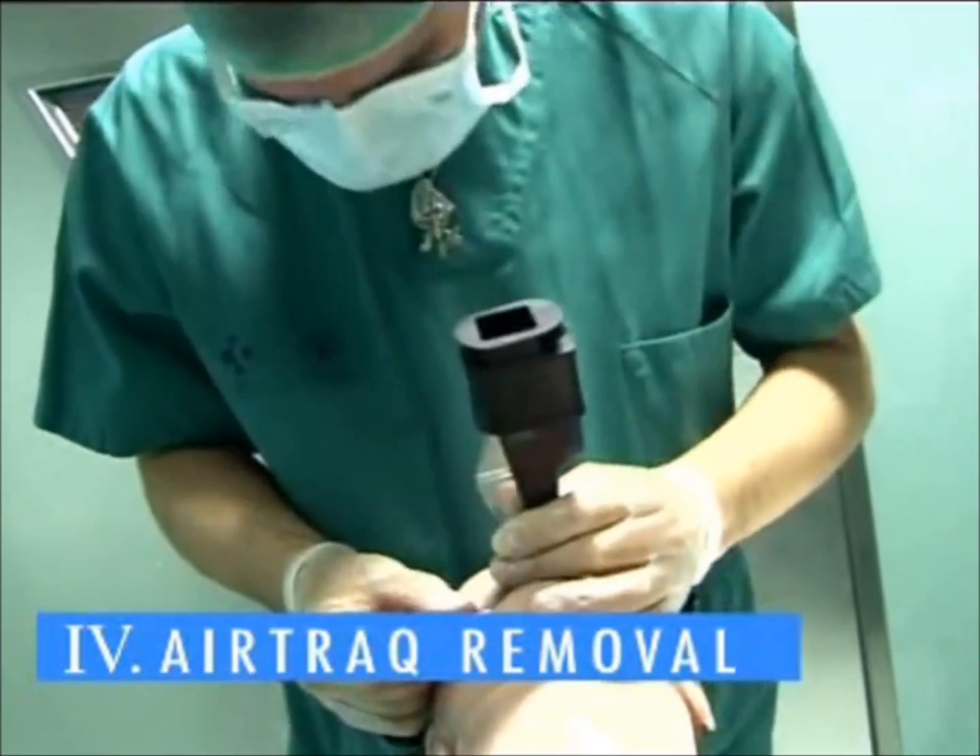To remove, grasp the ET tube, pull it laterally away from the guiding channel and rotate back and out of the mouth.